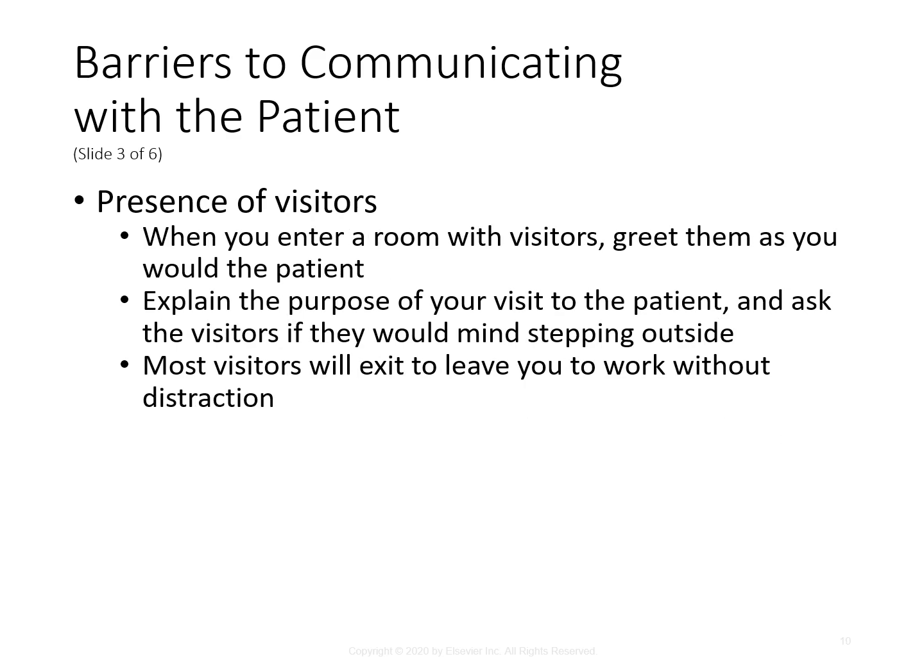Presence of visitors. If there is a visitor in the room, make sure that you greet them just like you would the patient. Explain, once again, why you're there, and ask the visitors if they wouldn't mind stepping out. Some will want to stay, some will not, so just make that an option for them. Most visitors will exit, like mentioned, to leave you to work without distraction. If the patient is a child, the presence of a visitor or family member usually can help during the collection. It can help calm them down in times like that, because children are generally pretty scared of blood draws.